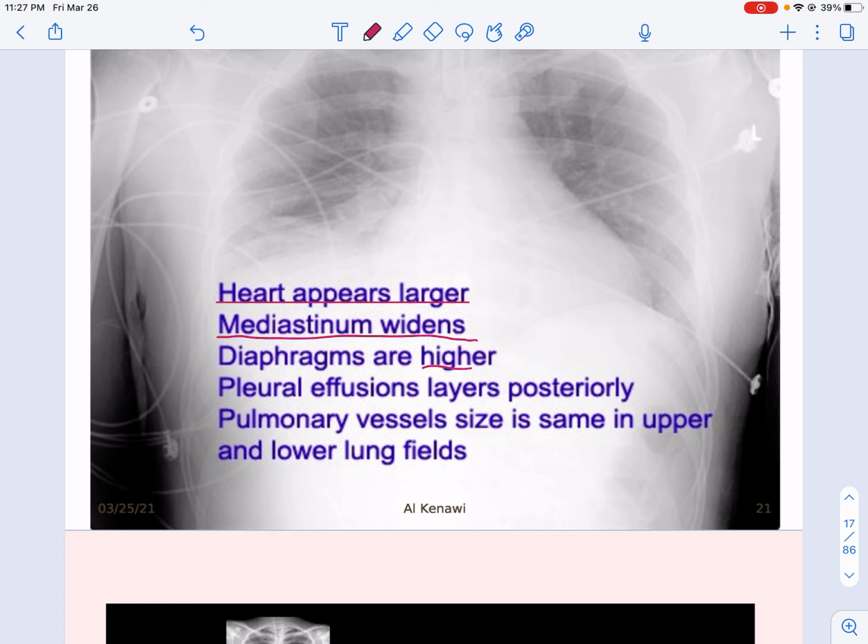Because we are penetrating the anterior structure first, and the heart is situated more anteriorly, and the diaphragm too. There is more anterior structure, like the liver and the spleen, or actually the liver and the stomach and all of that might interfere with the anterior posterior view.